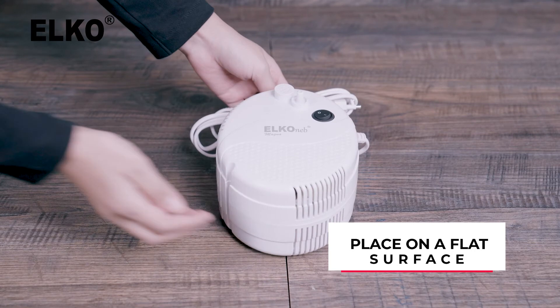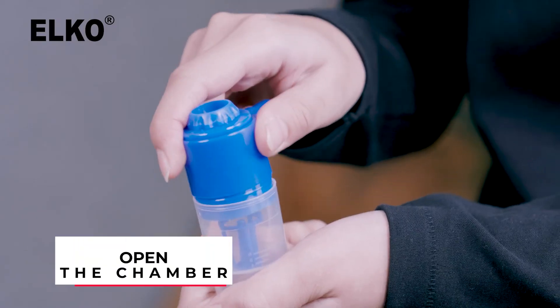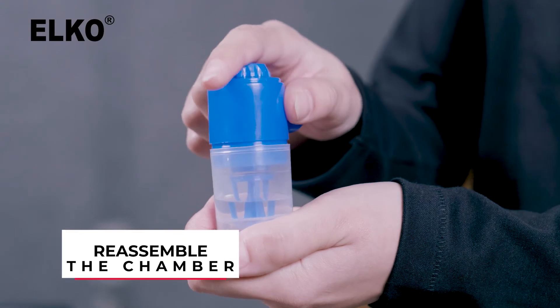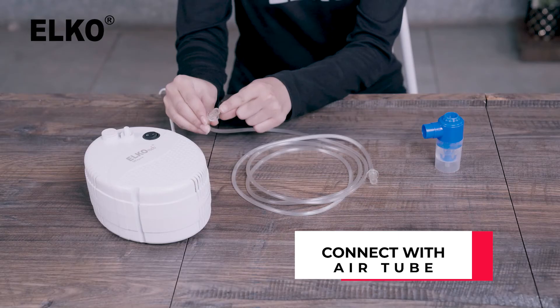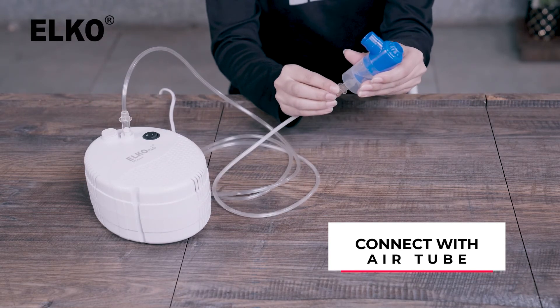To start your treatment, place your compressor nebulizer on a flat surface and attach the power cord to an electrical outlet. Gently pull the top of your nebulizer chamber and fill the bottom of the chamber with your prescribed medication. Now gently reassemble the chamber. The cup can hold up to 8 mLs of liquid. Once the sections are firmly fitted, attach one end of the air tube to the compressor and the other to the nebulizer chamber.